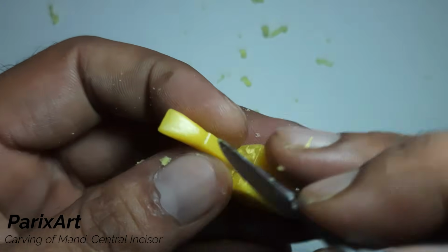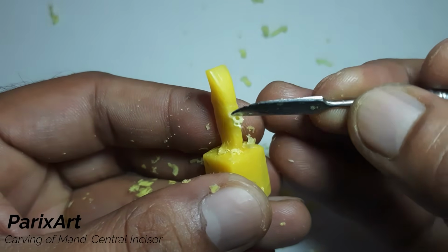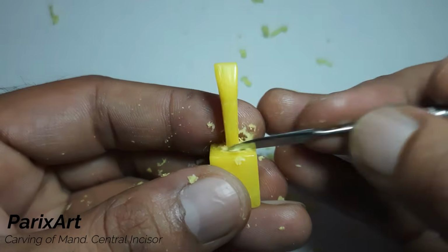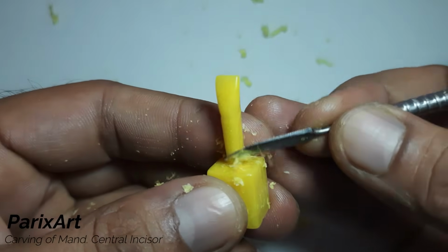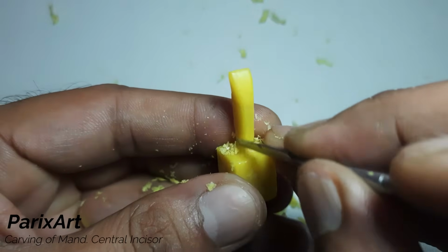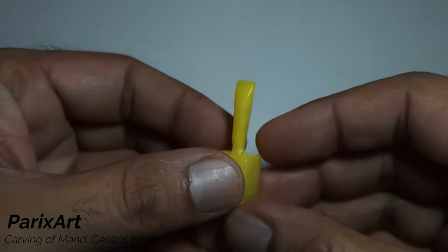Now the labial outline. Round off the sharp line angles. Okay, so gross outline is achieved. Now we'll do the detailing.